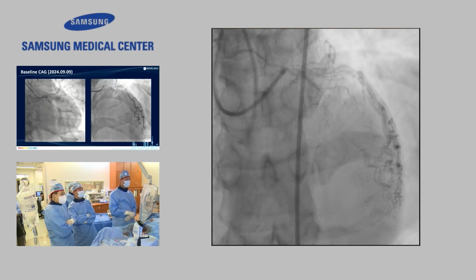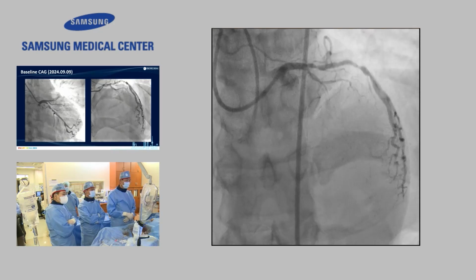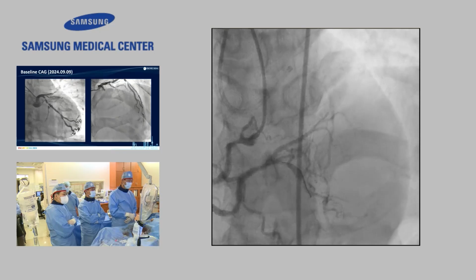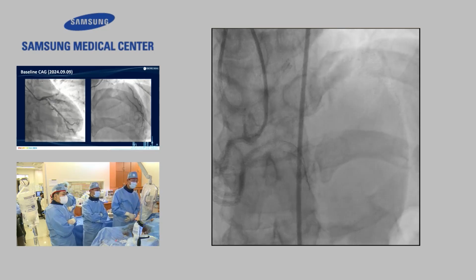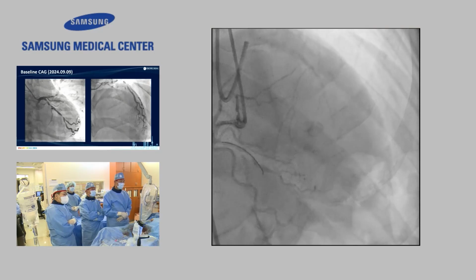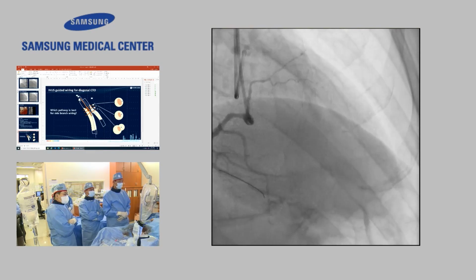Anyway, you can see the epicardial collateral. You can see the diagonal is coming from the circumflex. We did the bilateral angiography. You can see the LAD total lesion is very short, about 10 to 12 millimeters. Next. This is the cranial view, nothing much. Next.